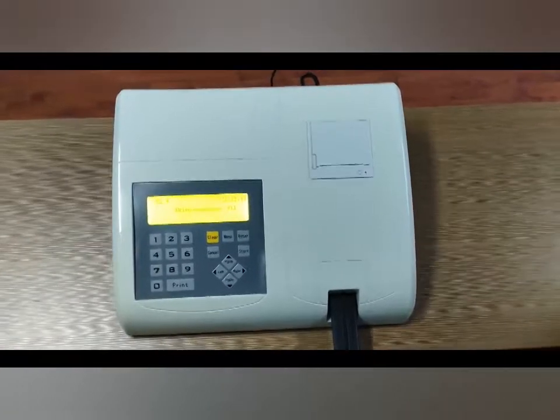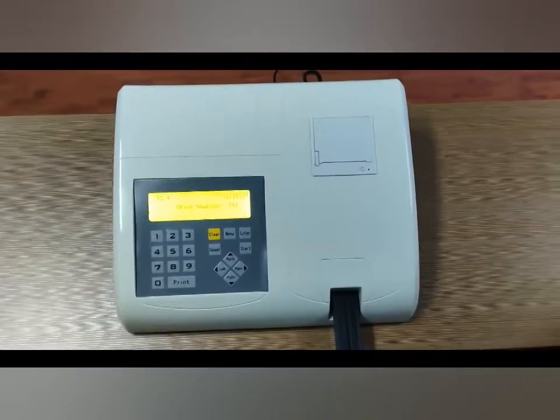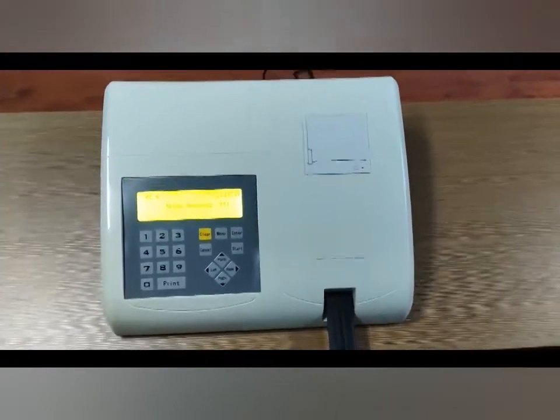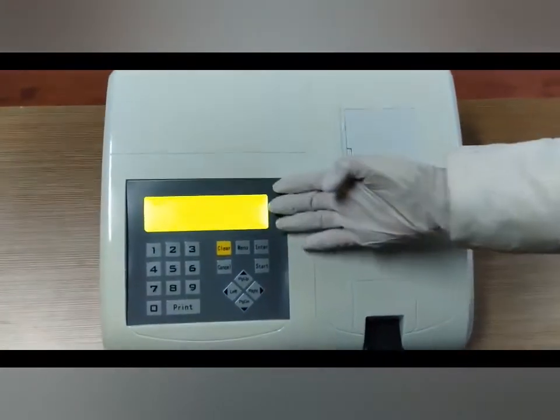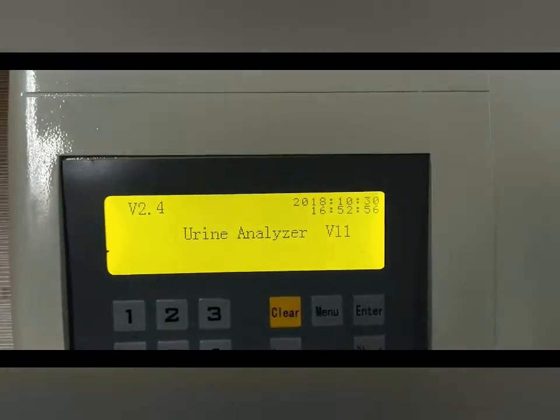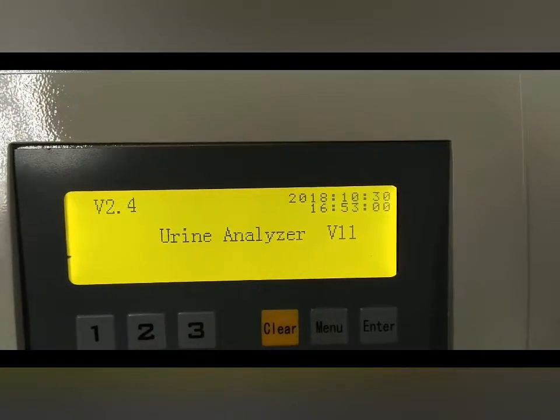This analyzer is portable and easy to use as a laboratory instrument. It consists of the following five components. First, an LCD monitor showing the interface, menu, test report, and internal values.